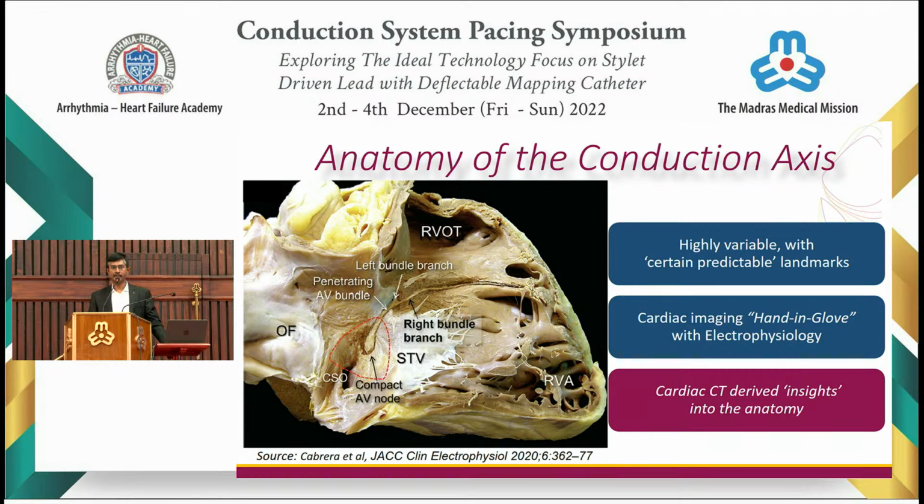As Dr. Gaurav Upadhyay had shown in his presentation previously, we are in no mood to bin His bundle pacing, especially when it comes to correction of left bundle branch block. His bundle pacing is always up our sleeves, and still we are exploring the options, how to optimize His bundle pacing for various clinical scenarios.